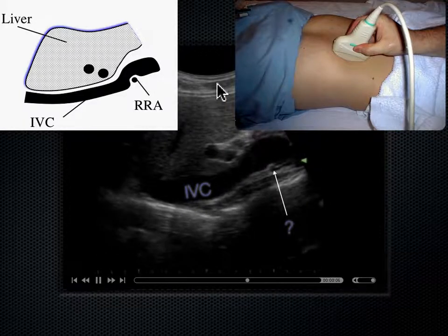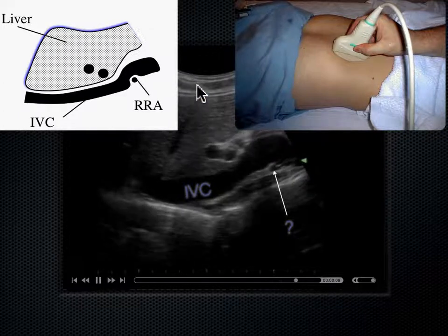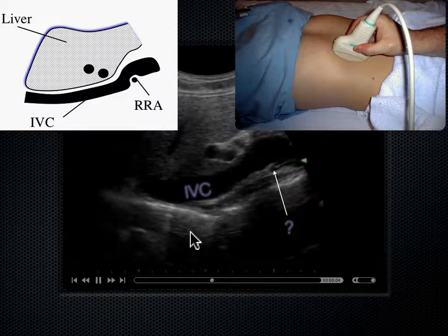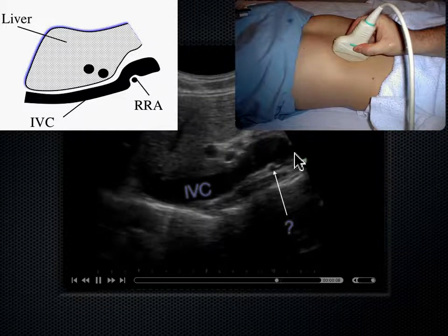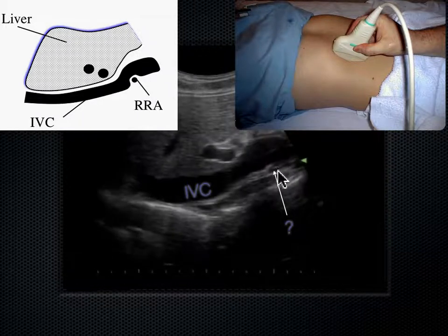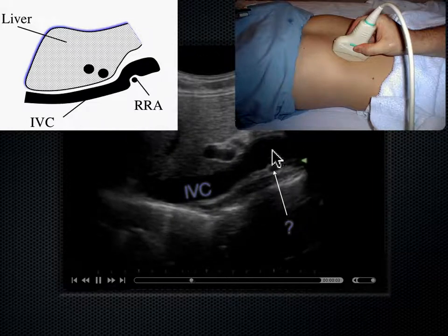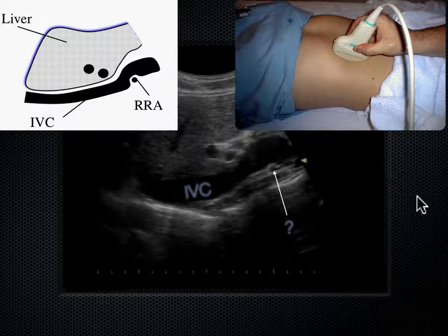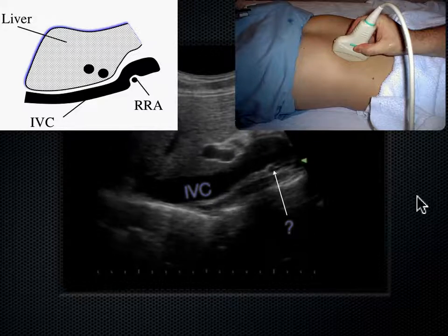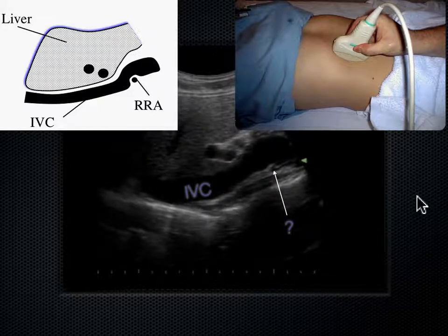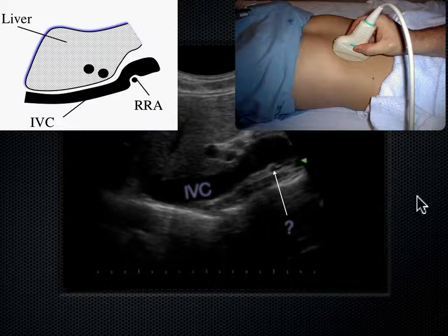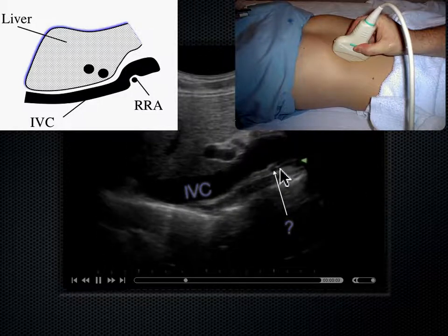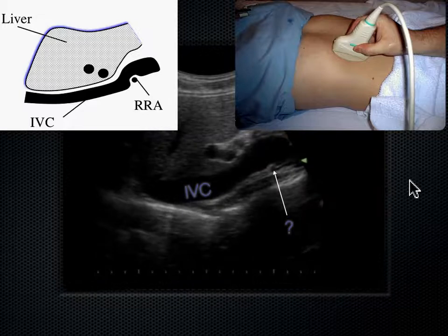With the probe on the skin anteriorly and sound going posteriorly, we can see a vessel lying posterior to the IVC yet perpendicular to it — it appears round, in short axis. That's the right renal artery (RRA). Blood travels from the aorta on the left side of the body over to the right kidney by going behind the IVC. That's a common landmark we see on ultrasound.